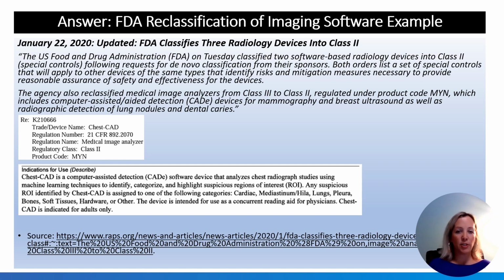This is a great question. I don't know the algorithms and exact functionality of your X-ray software, but it could be a standalone software that could operate with other types of devices or other types of X-ray devices even. It could be a component and it could be an accessory, just depending on the functionality and how it interfaces with the device, how specific it is to that device and the functionality and how generic or specific or custom that is.